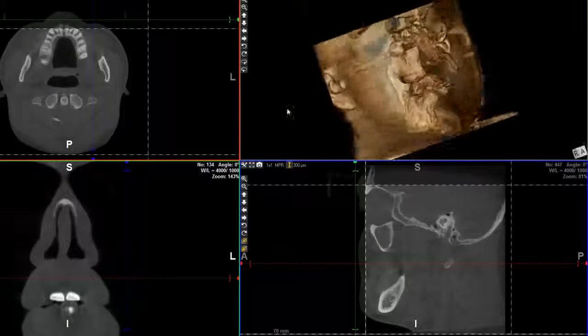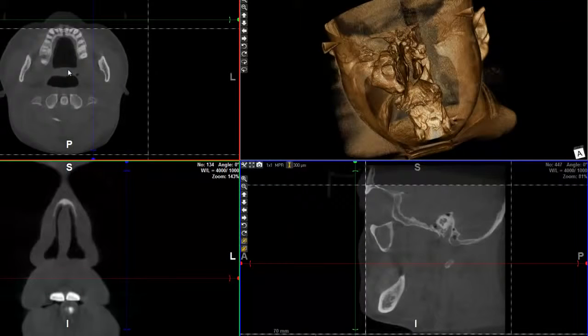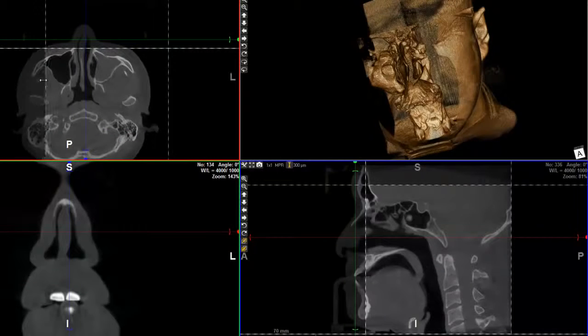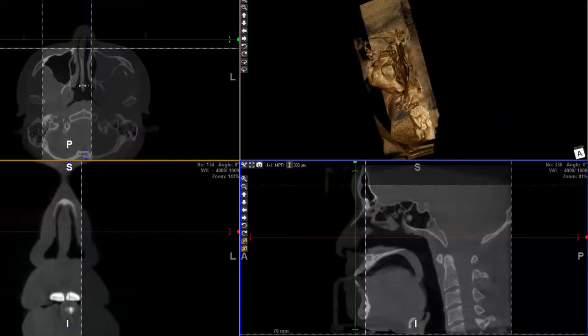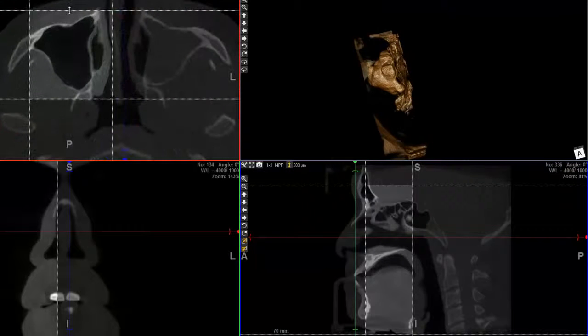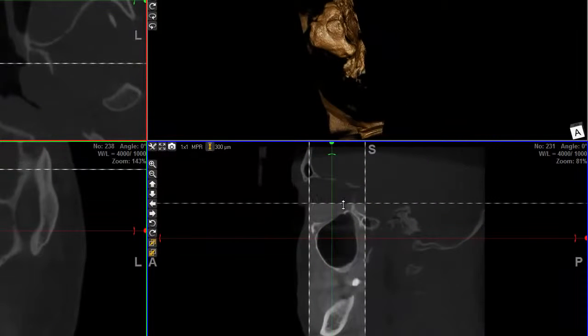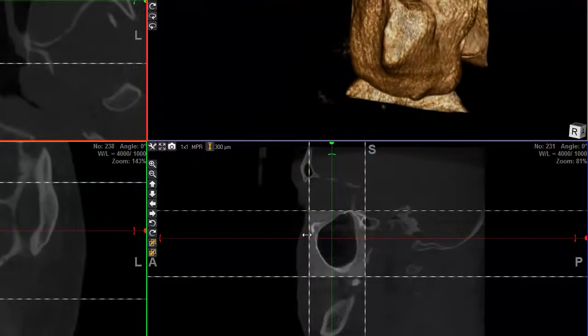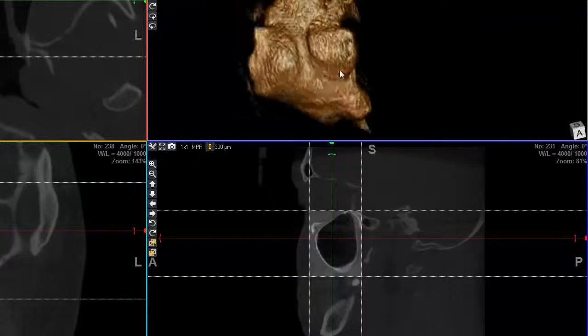So let's now isolate this sinus. For that it's quite easy. I'm going to zoom a little bit, and I'm going to frame the sinus using, of course, zoom when I can to make it more precise. Exactly. And slowly but surely you will see that the shape of my sinus is going to appear. That's a nice sinus, this one. Like this, like this, like this. There you go. We get our sinus.